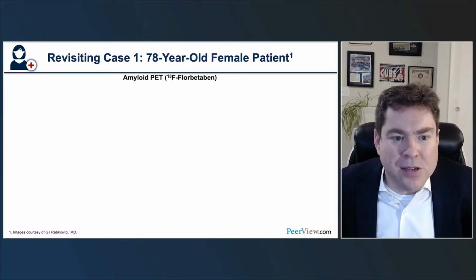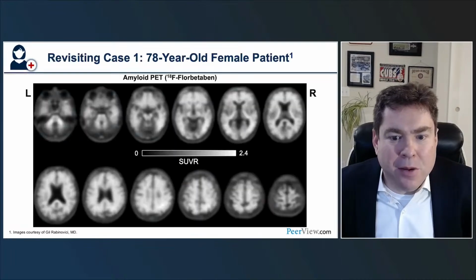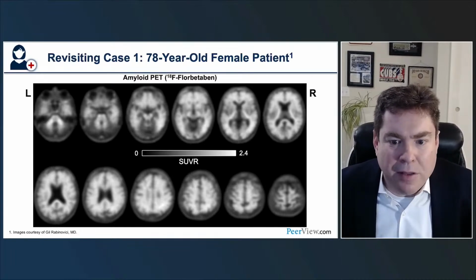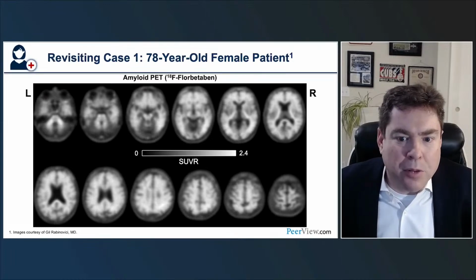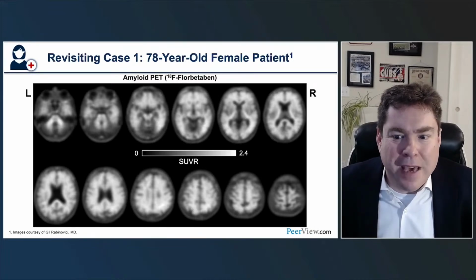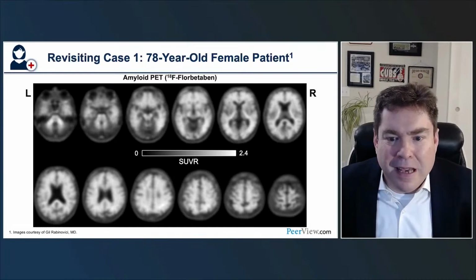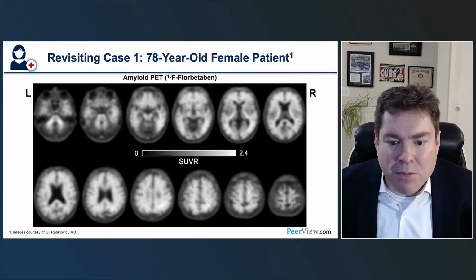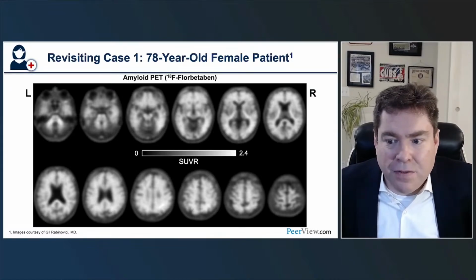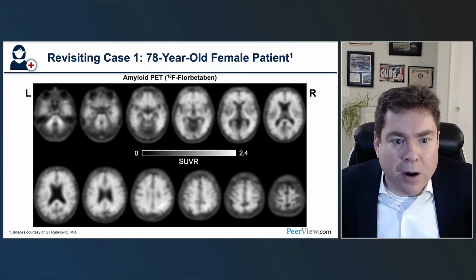We went ahead with amyloid imaging using florbetaben PET, and here the results are pretty unequivocal. As you've learned from Dr. McConathy's lecture, this is a clearly positive amyloid PET scan with neocortical uptake throughout both hemispheres. The centiloid value in this case was about 105, so a clearly positive test, both by visual interpretation and quantification. And so if the MRI in the clinical scenario was a little bit ambiguous, I think the amyloid PET scan provides definitive evidence of Alzheimer's disease and actually qualifies the patient for diagnosis as a core 1 biomarker.